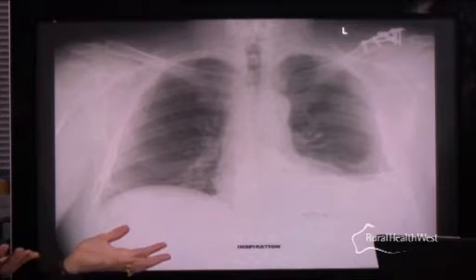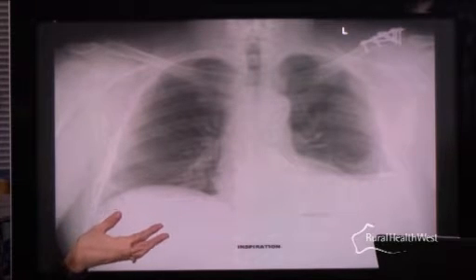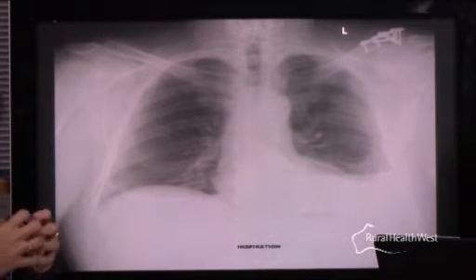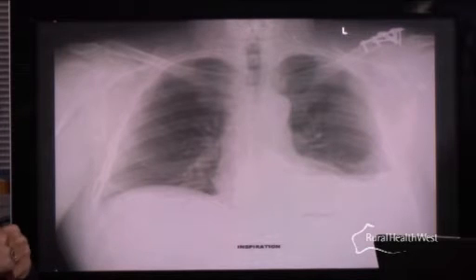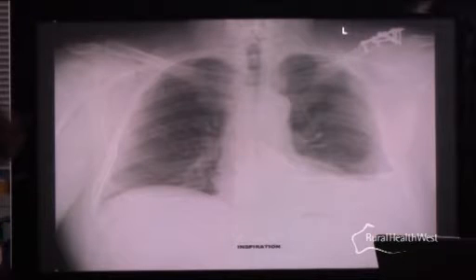Rodney, the other very stressful thing in a country emergency department is the trauma patient. This is one of my local farmers who, as you can see, has previously had some surgery on his clavicle, and he presented having had quite a severe car accident. He actually presented a couple of days later saying, I'm really very short of breath and my shoulder is killing me. When I sent him down, this is what came back.